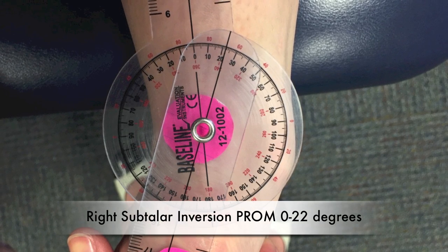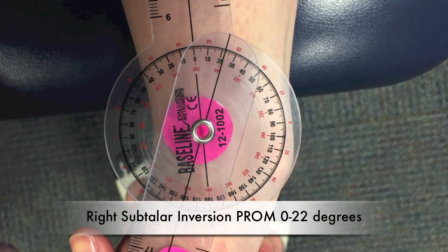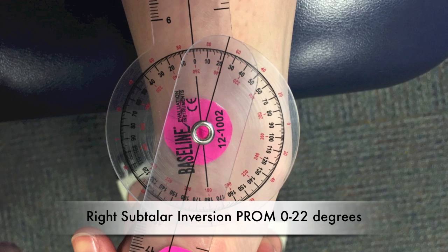Right subtalar inversion passive range of motion: 0 to 22 degrees.